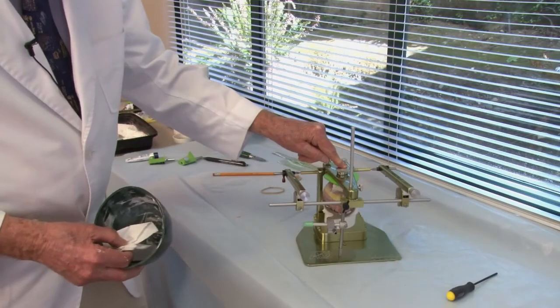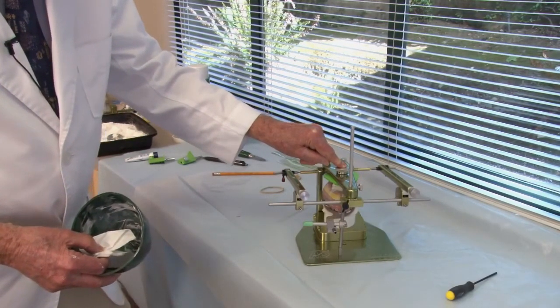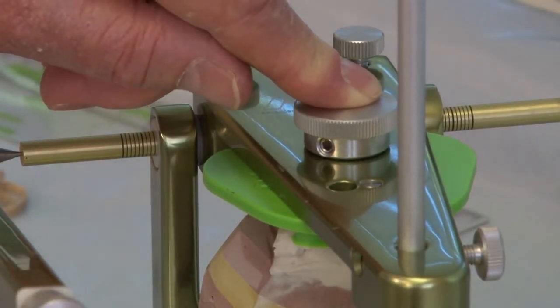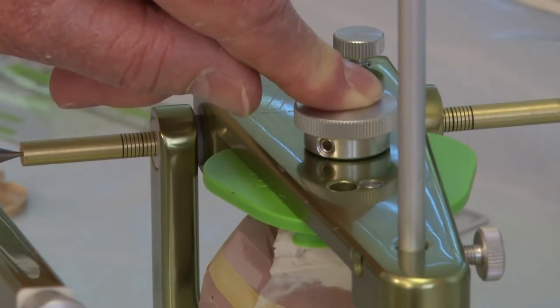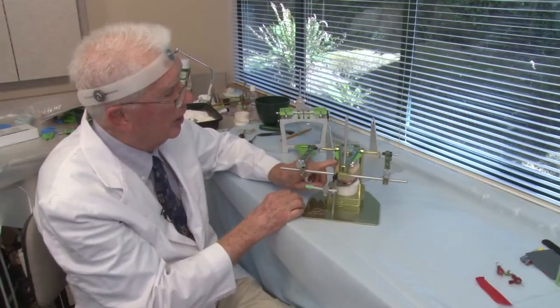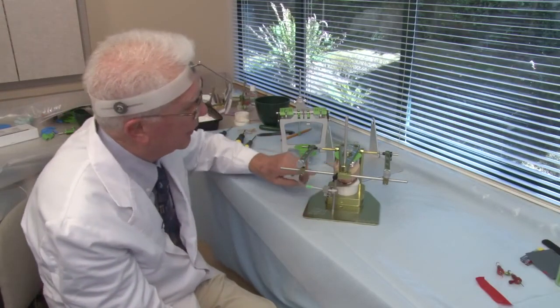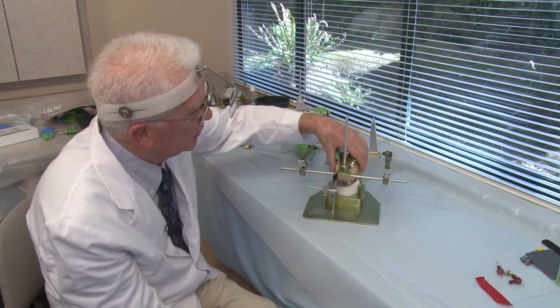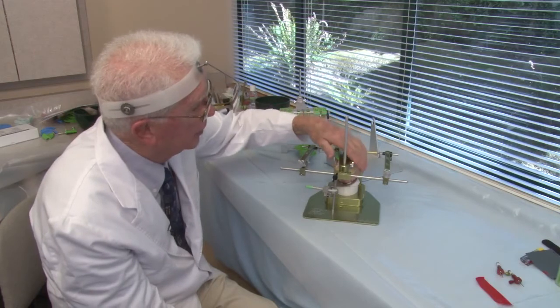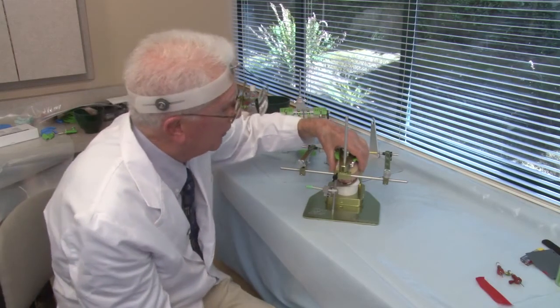After you add the plaster and close the articulator down, hold some pressure during the initial set of the plaster, or put some rubber bands. This is to counteract the expansion of the plaster. It's hard, that's good. Now, this is a split cast model, so I have to be very careful how I handle it. If I try to just pick up the entire model and don't just open it up, I may break the model. So I have to be very careful.